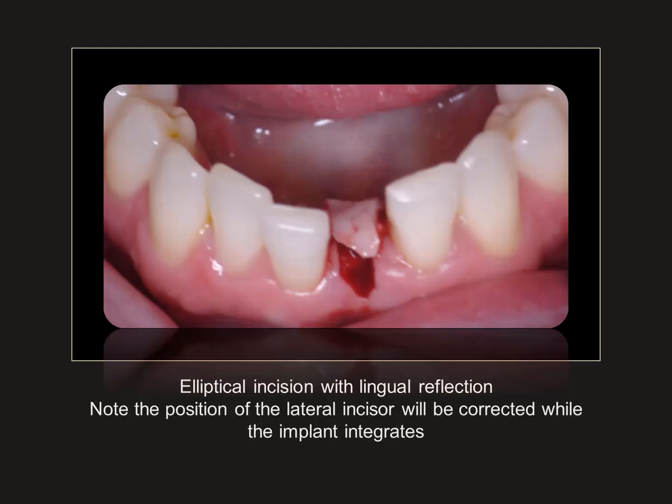To place the implant with this guide, an elliptical incision was made with reflection of the small full-thickness flap lingually. Often the flap will be held out of the way by the surgical guide.